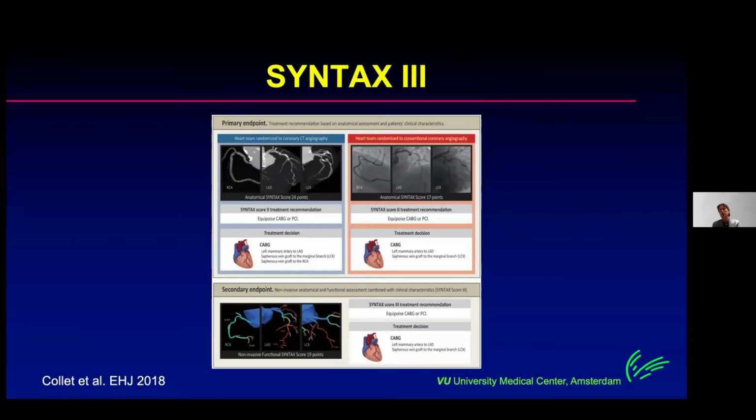So in 93% of cases, the heart team decision in terms of 3-vessel disease was exactly the same as compared to invasive coronary angiography as compared to a CT-based coronary angiography. So we're now moving into an era where we no longer need to inject dye in contrast and puncture patients to see what their coronary angios look like and whether we should or should not perform intervention.